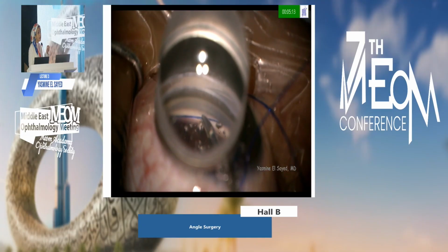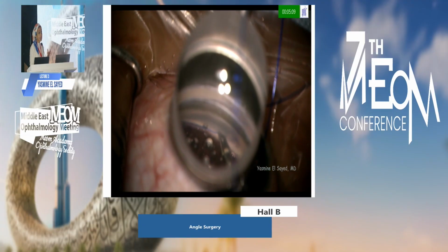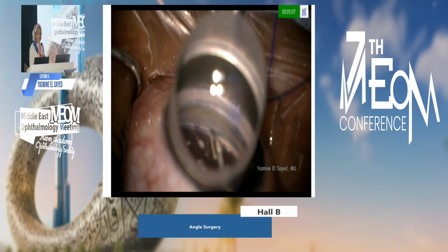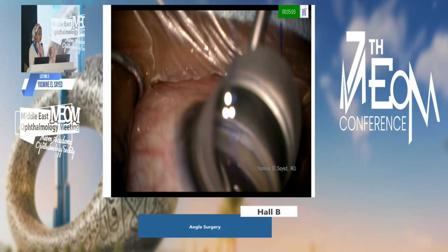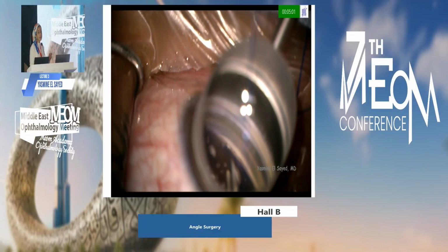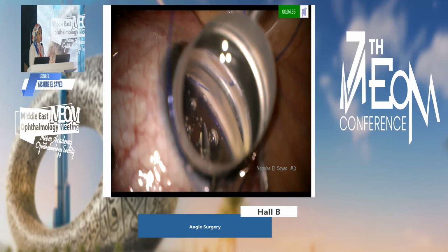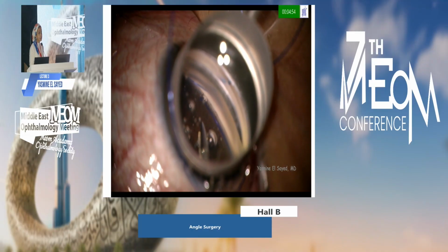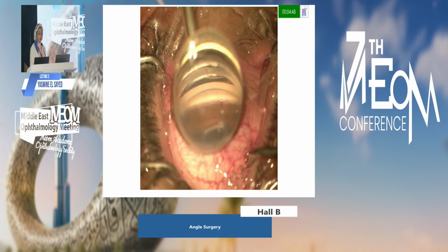But sometimes, infrequently, it does, particularly in children. They have a sort of fragile Schlemm's canal. So sometimes, even though your first entry is in the correct plane, you'll be surprised that the suture leaves the canal prematurely and comes out of the opposite side. This is manageable. You can still create your incision and then go in from the opposite side, just like with the Omni device, and do it through a two-sided 180 degrees.